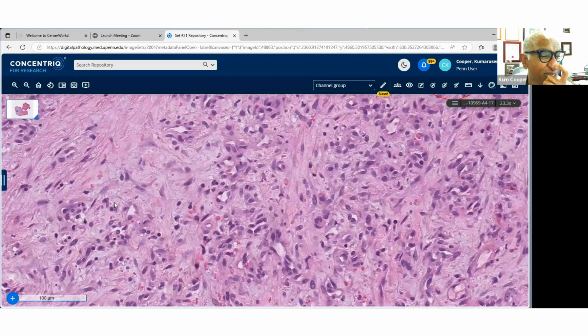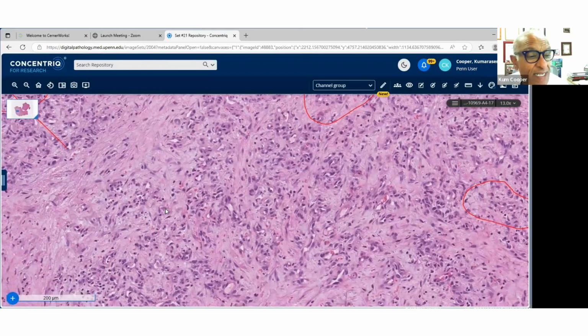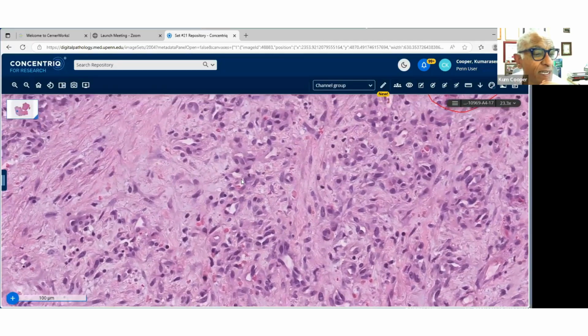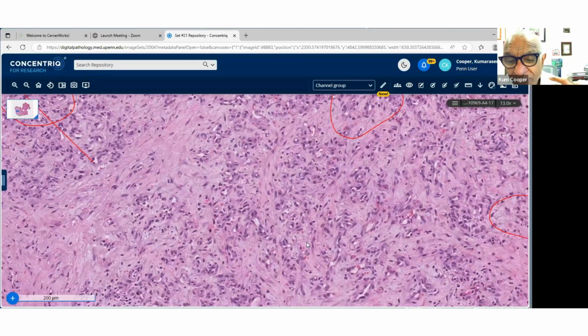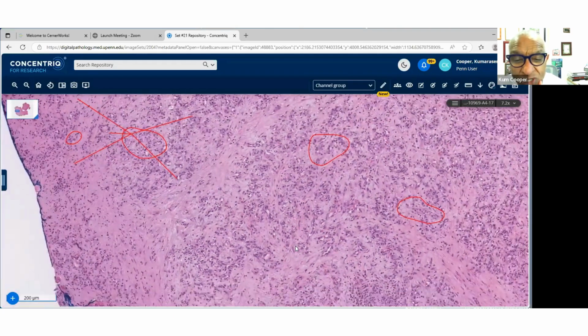Okay, I've got epithelioid hemangioendothelioma, EHE as we abbreviate it. Good thought, good start. And I'll address differentials as they come up. Two thoughts to that. These form lumina. You can see little vessels. Also the EHE typically has cords and nests, but embedded in a chondromyxoid or myxohyaline stroma.